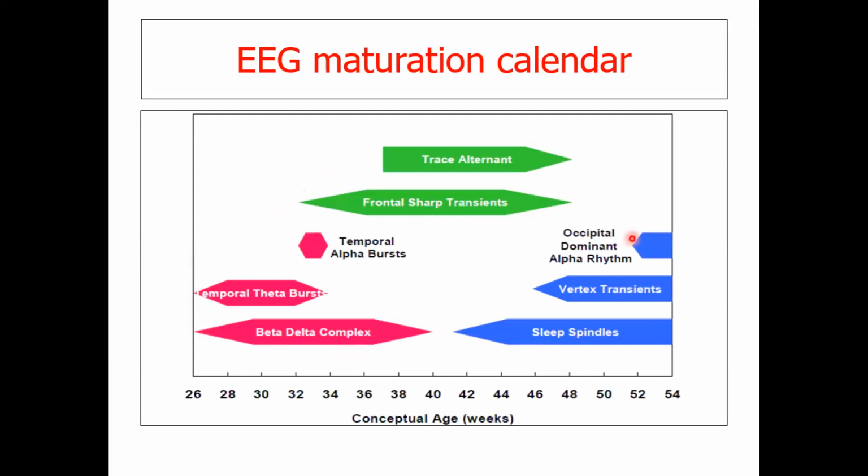With this cartoon, I would talk about the EEG maturation calendar. I would not venture to go into the development of sleep, development of vertex and things like that, because it would make the talk even more theoretical. So just focus on this.